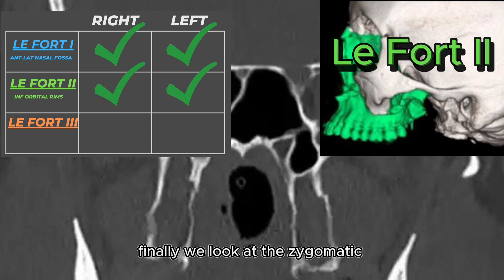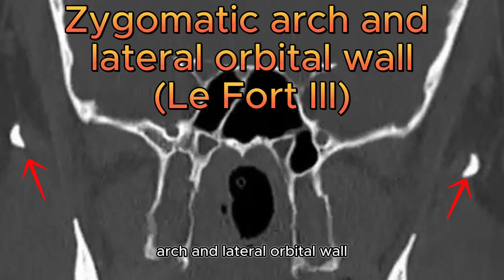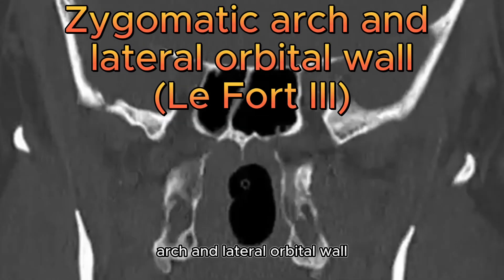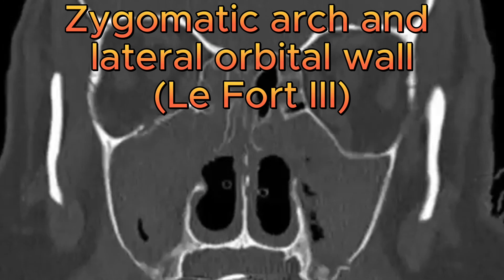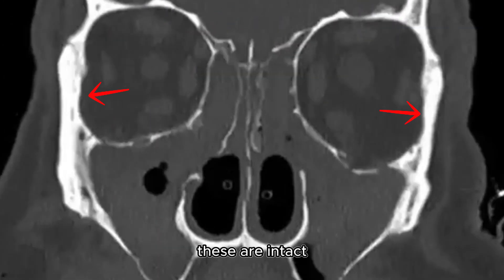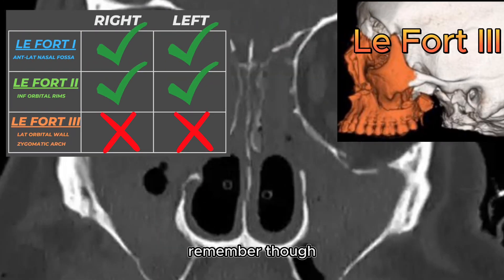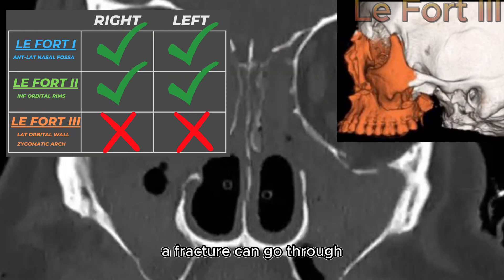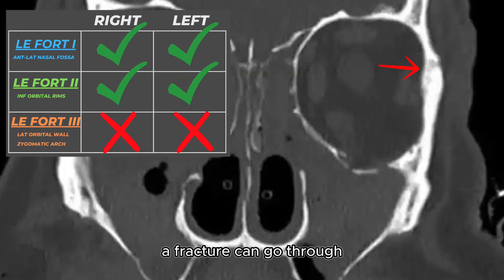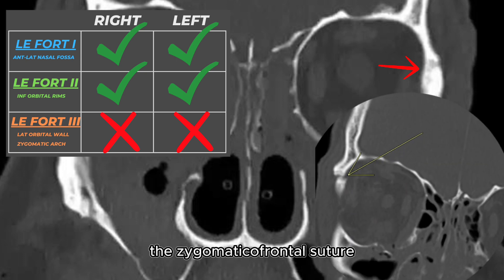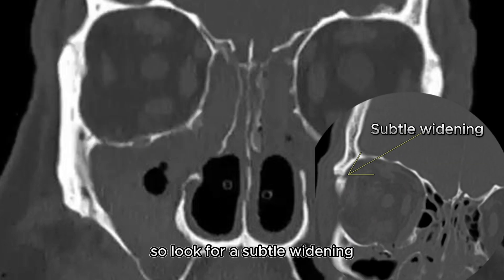Finally we look at the zygomatic arch and lateral orbital wall. These are intact. Remember though, a fracture can go through the zygomatic or frontal suture, so look for a subtle widening.